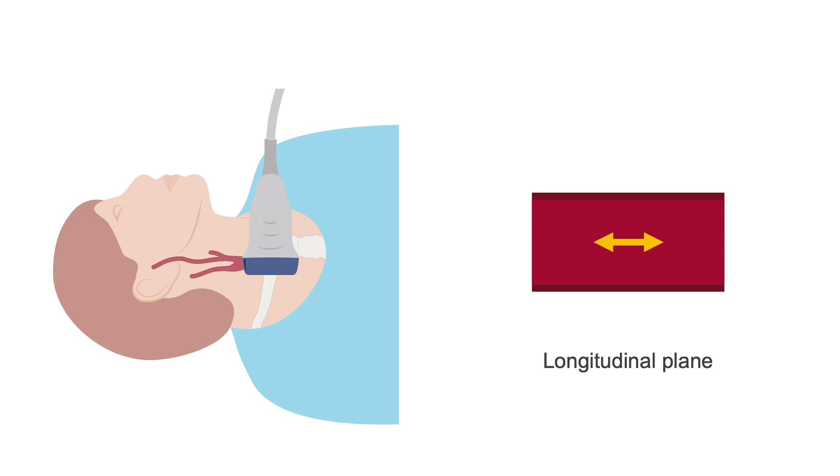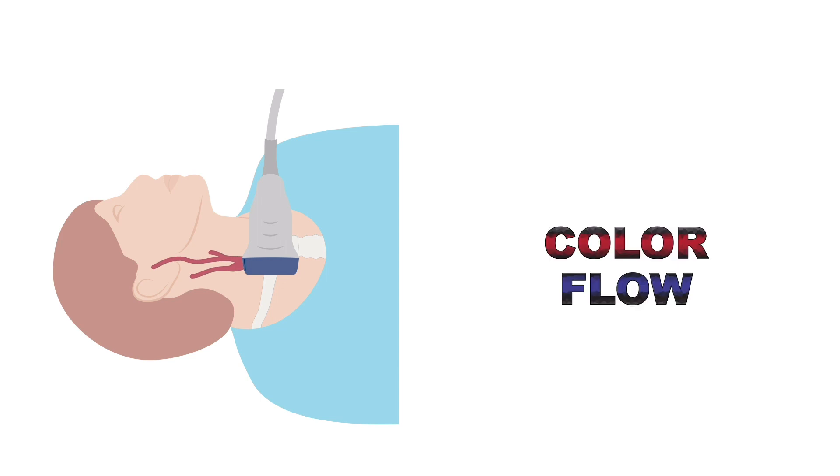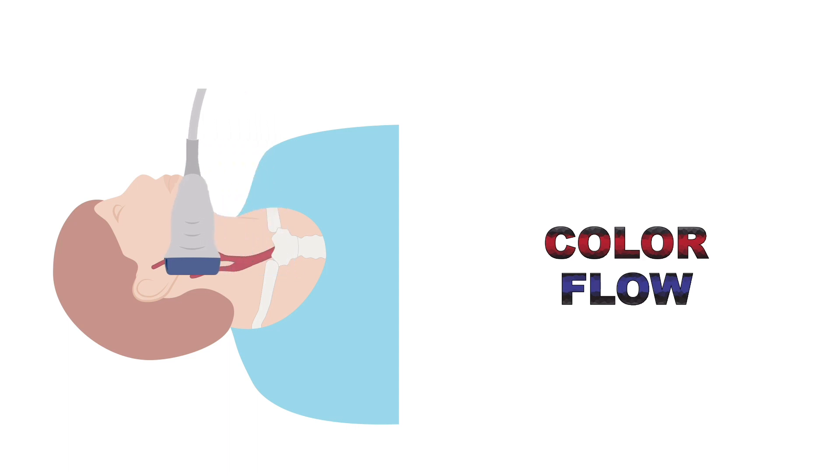Still scanning in the longitudinal plane, move back down towards the base of the neck and switch on the colour flow. Then travel back up the neck to help identify areas of high velocity and aliasing.